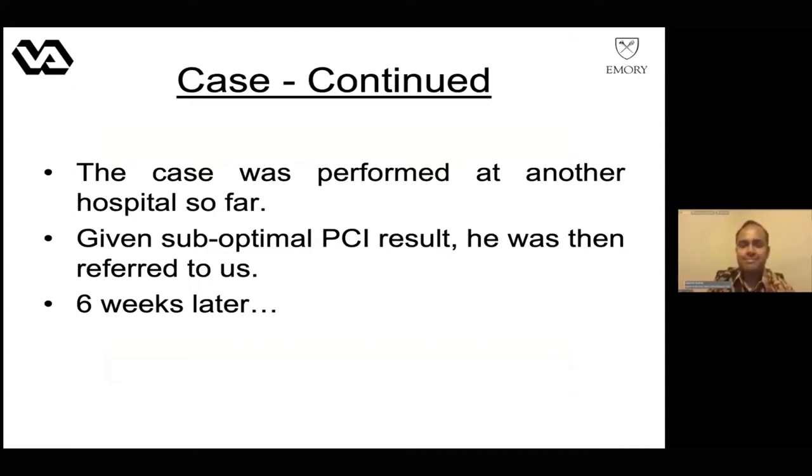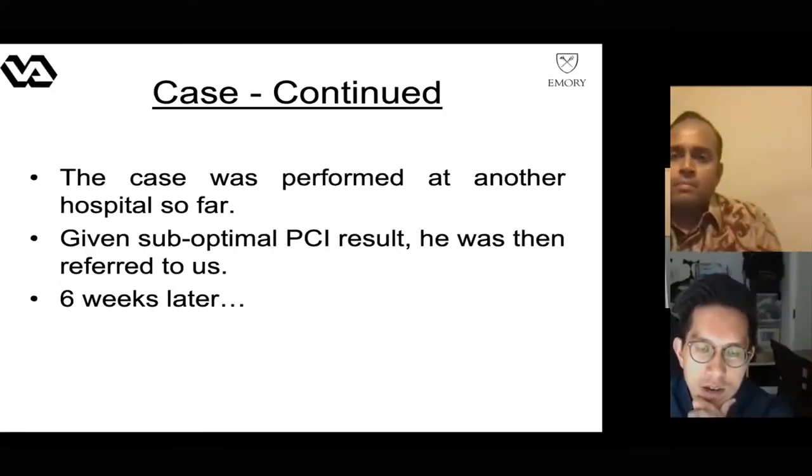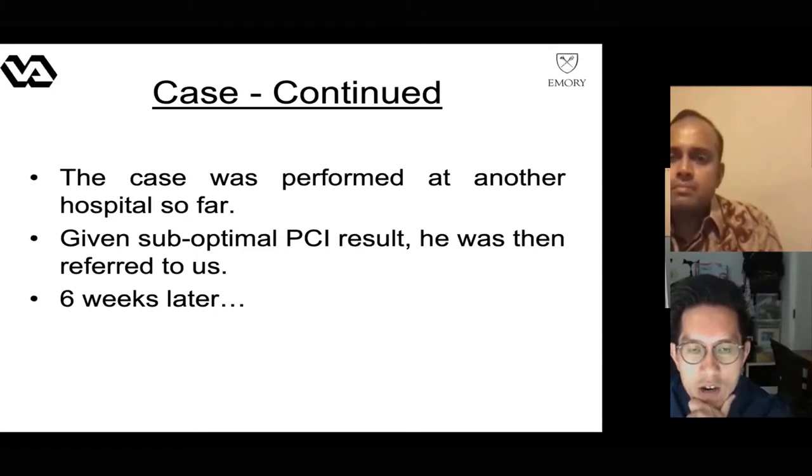Hi, I think this is a very good case illustration. And of course, I think the second part of the story is even more interesting. But at this point, I think in the second PCI, the stent we just put in, we can all agree that in case of ISR, it's very important to use intravascular imaging because we need to know the mechanism. In case of ISR, is it atherosclerosis or is it the first case having an underexpanded stent?